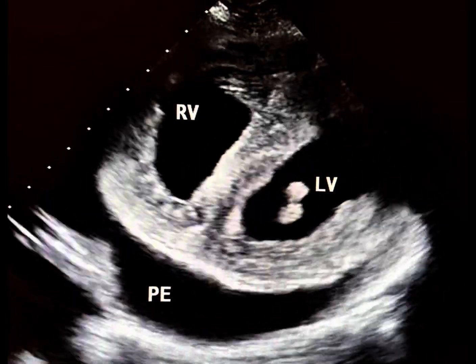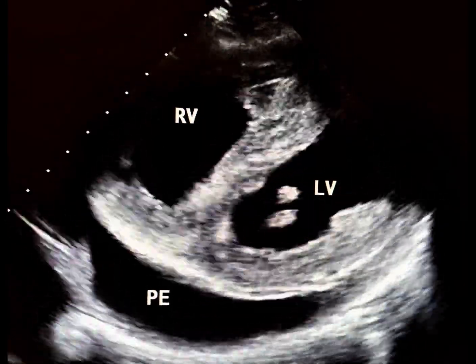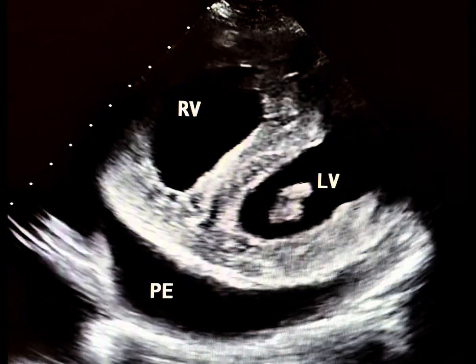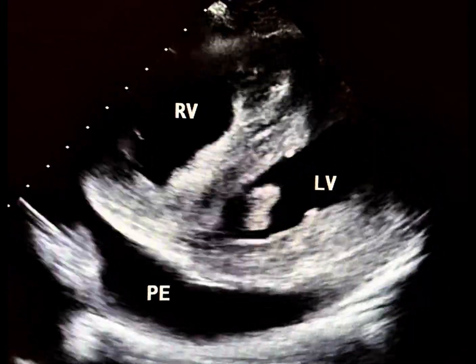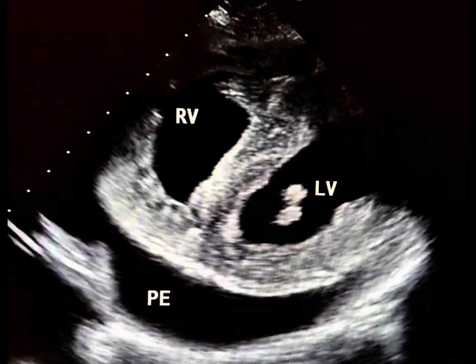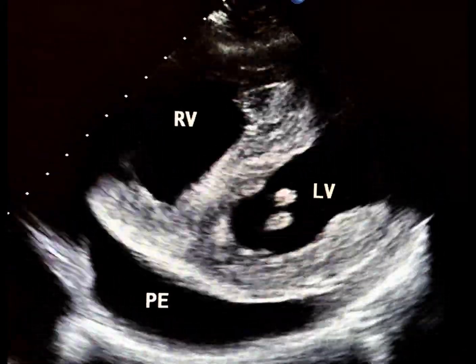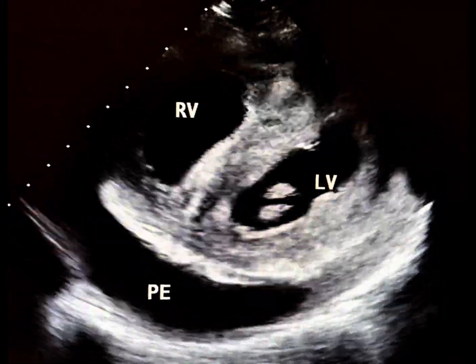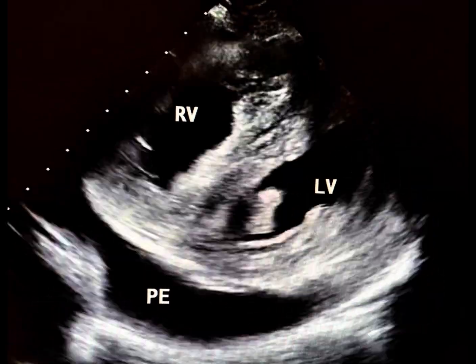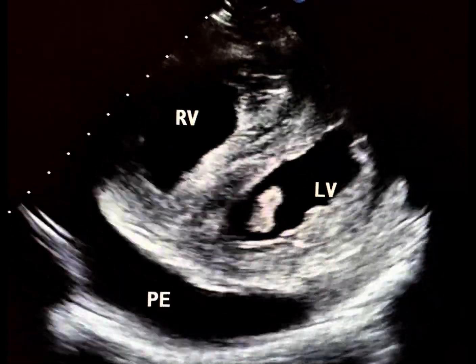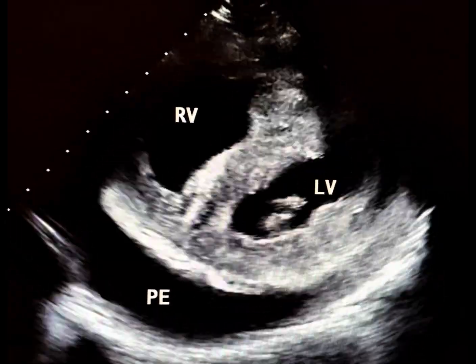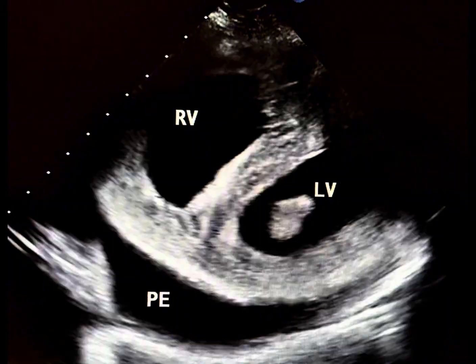This short axis view demonstrates right ventricular enlargement with severe right ventricular hypertrophy (RVH). A pericardial effusion, an ominous sign in pulmonary hypertension, is also present.